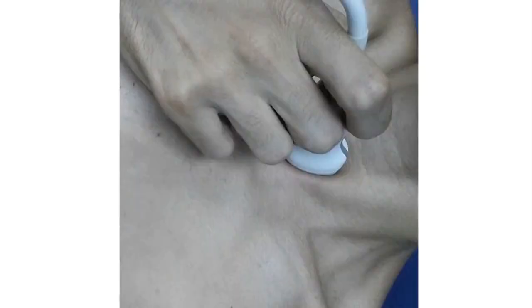The suprasternal view is obtained by placing the probe in the suprasternal fossa, directed downwards, with the knob pointing towards 11 o'clock. Adjust your position until you get a view like this.